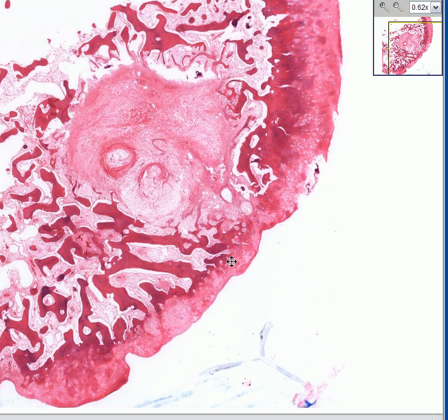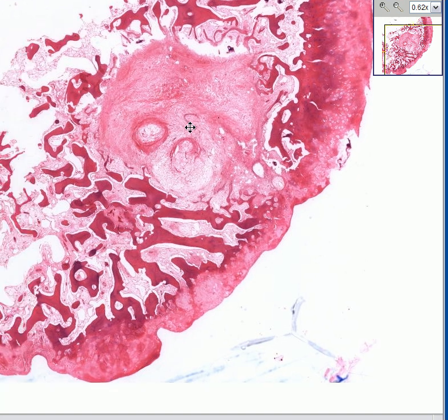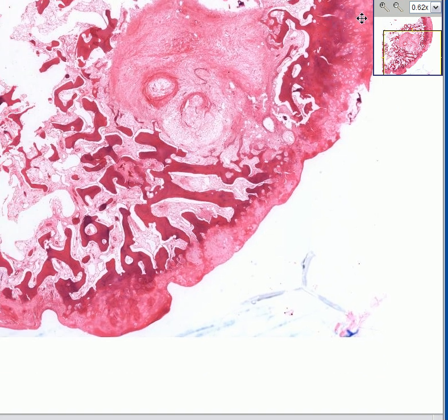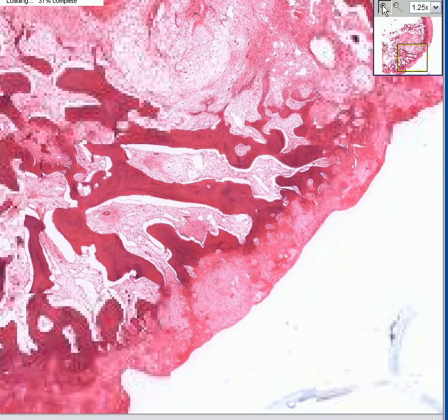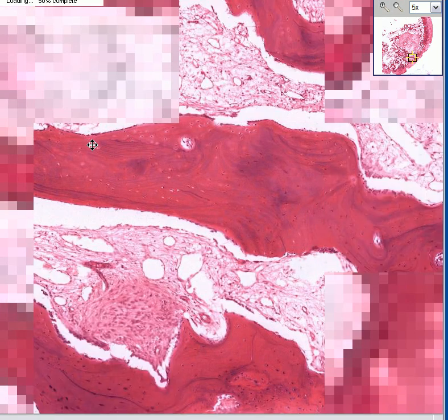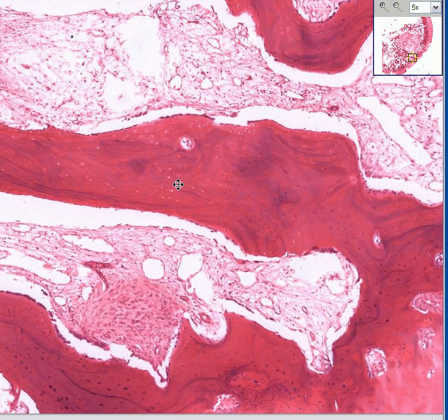If this is the cartilaginous surface — the chondral surface — then this is the subchondral area, and you can see that the bony spicules are replaced by fibrous tissue. Just so you understand what a bony spicule is: this is a spicule of bone, and you can see the osteocytes trapped within the lacunae.